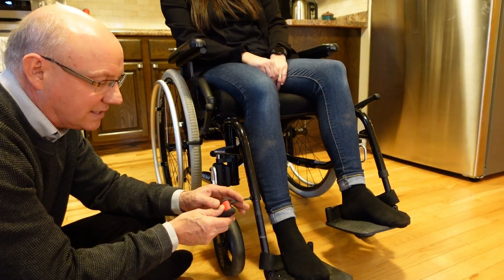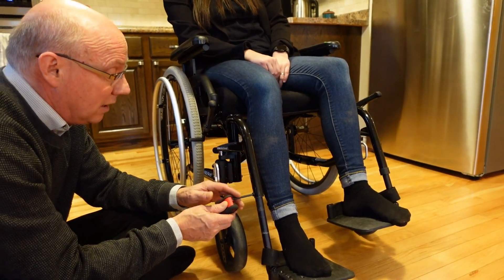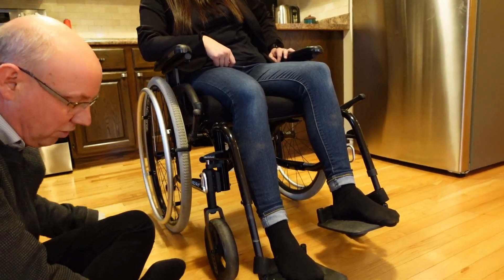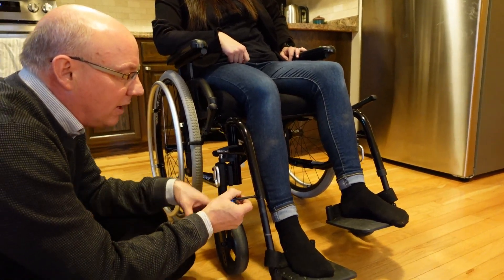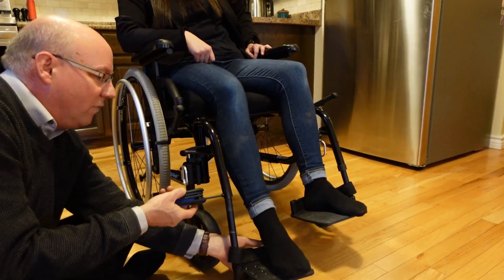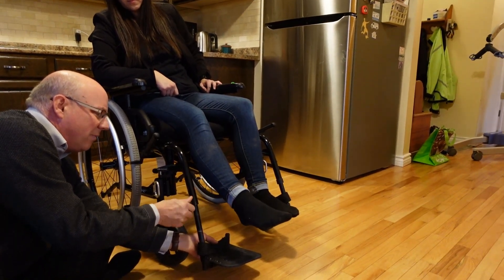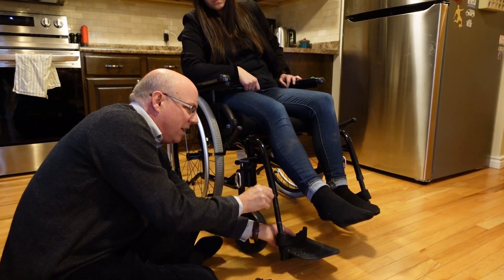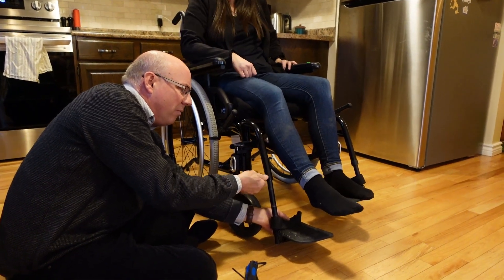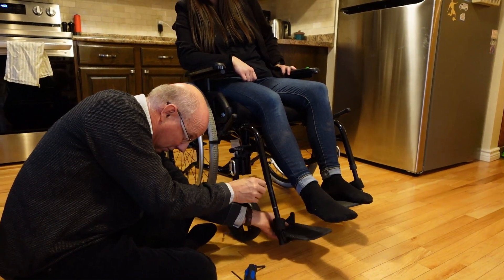You have to have the right size Allen key to adjust these footrests, no matter what wheelchair. If you strip them, it's really hard — it messes everything up. So we're going to do this right now. If you could just move your foot for a minute, I'll take the screw right out. You just pull the particular bolt out of the hanger and you can bring it up. Thread it in — you do have to undo the thread.